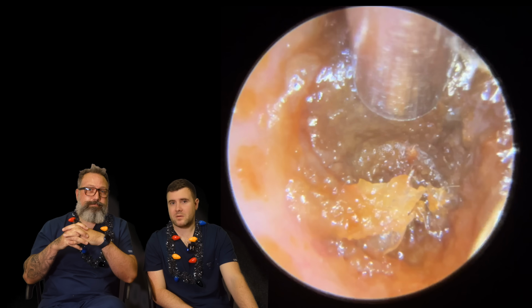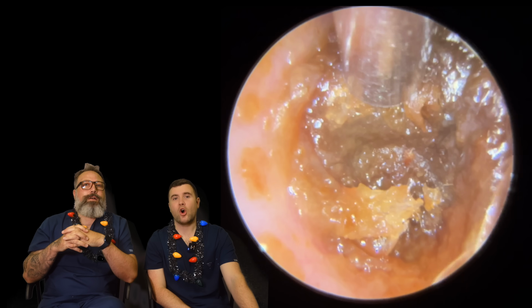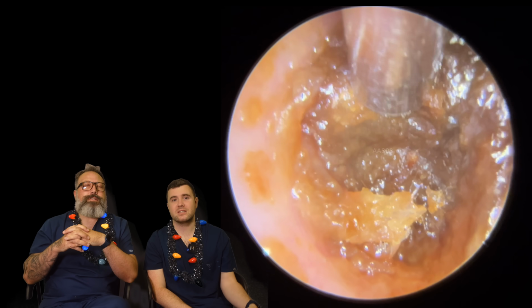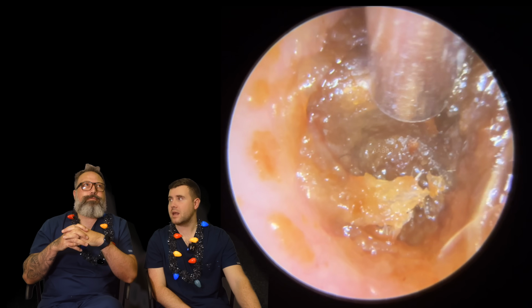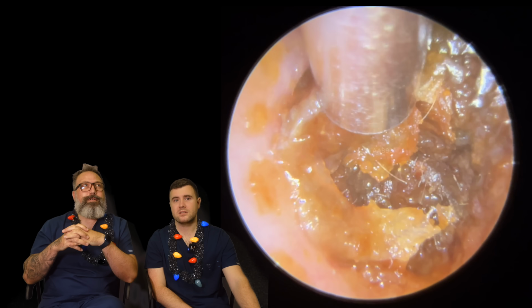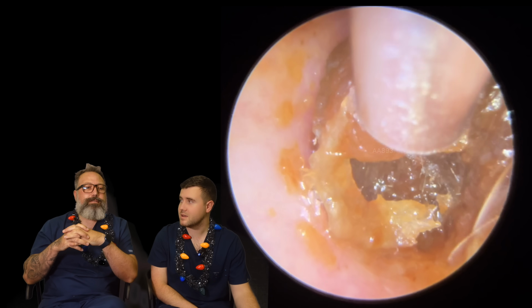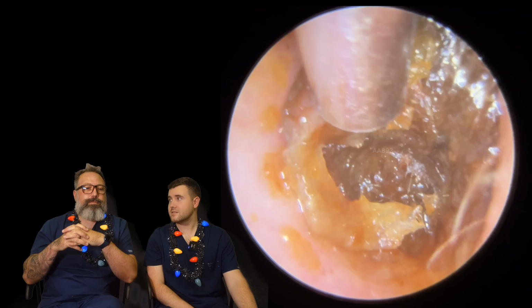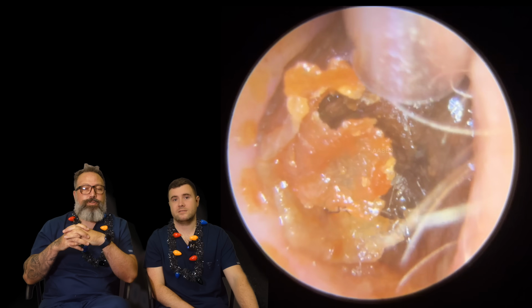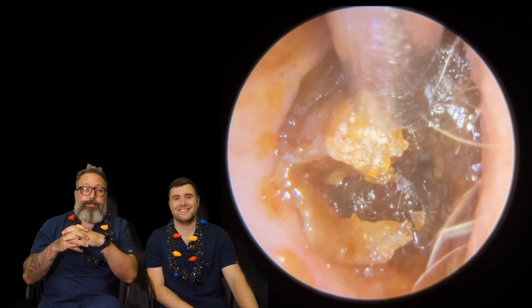We've had a lot of people asking what the tube that we use is actually called, and it's Zollner. Zollner tube. Don't ask me how it's pronounced, I can't remember. Zollner, yeah. Zollner tube, named after Mr. Zollner, I presume. Yeah, there you go.